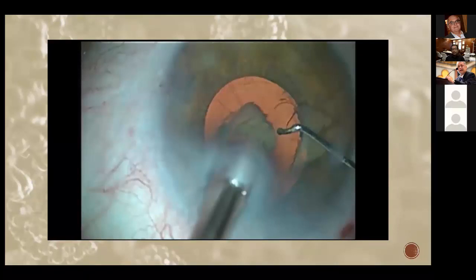I was a little bit afraid. I didn't know the thickness of the nucleus. I thought it might be very thin. So if I embed, I would perforate and go to the other side. That was my concern at the time. But yes, you're right. Once I appreciated what the thickness was, I could have.